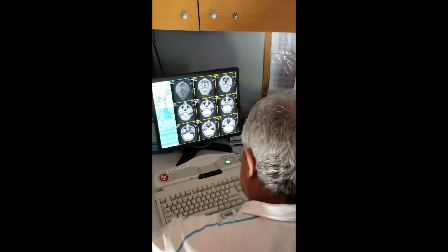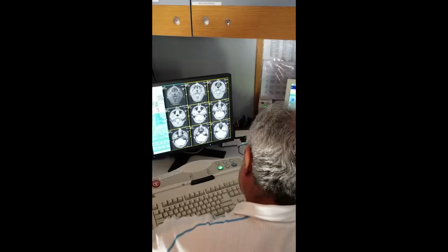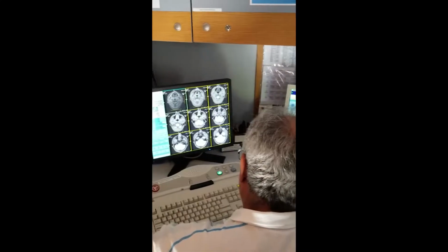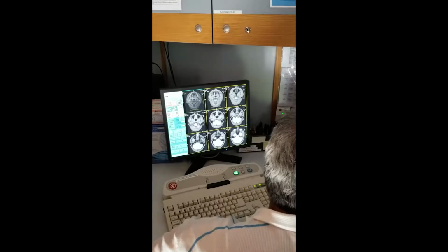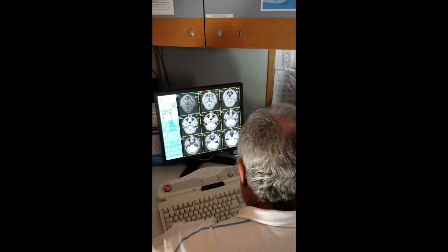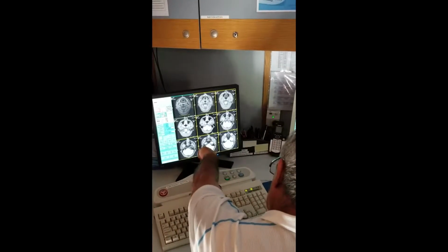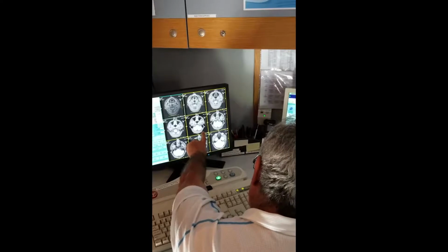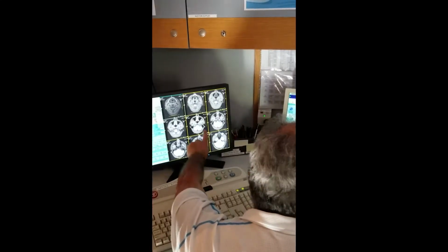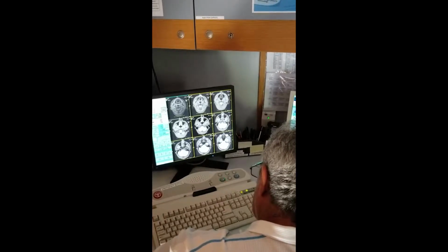So now I say zoom this 1.1. You do zoom. Will they specifically ask for that? No. Physicians, you just send them to PACS, they do whatever the hell they want. So then I say adjust window and level. Usually you want to get the background, you see this here? You want to get it dark like me. You see the difference?